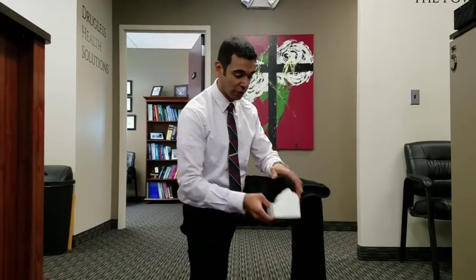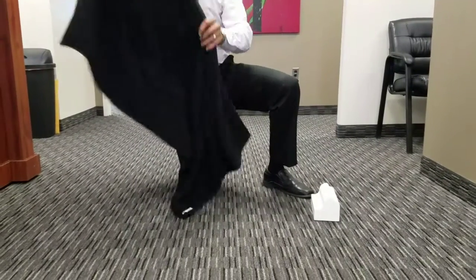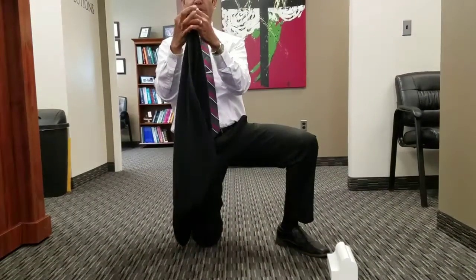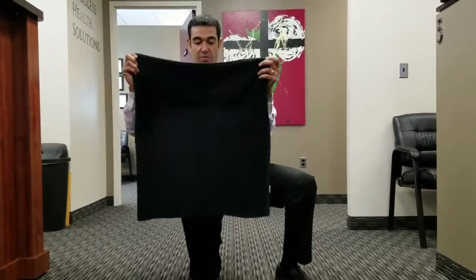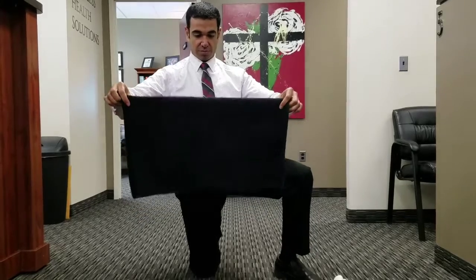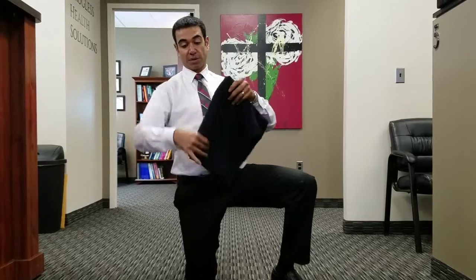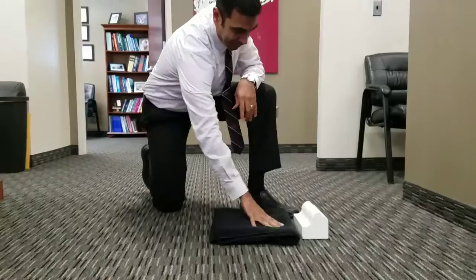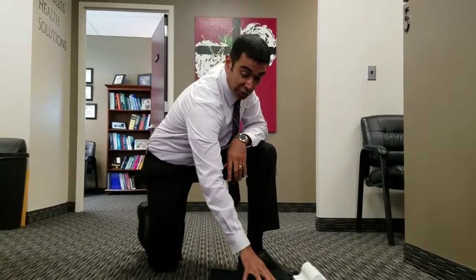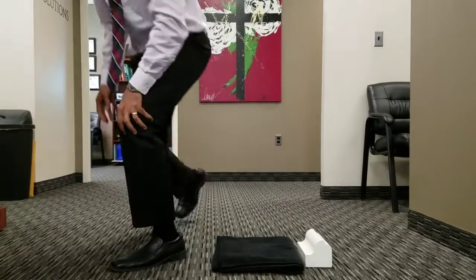If you find that it's painful, what you do is you take a towel, and this is just a regular bath towel, and fold it up a couple times. And depending on how thick you want it, you can even fold it a lot more like this. And then you put this here where this is. This will elevate your upper back just a little bit so that when you put your head over this, this won't seem like it's so high. So it'll look like this.